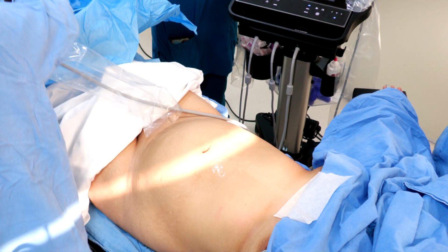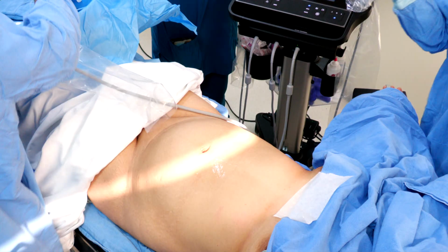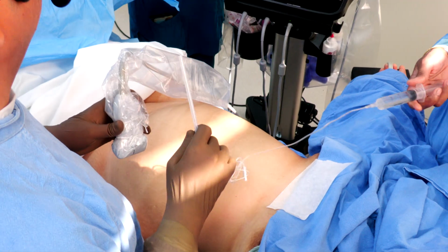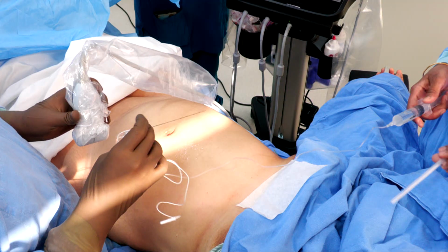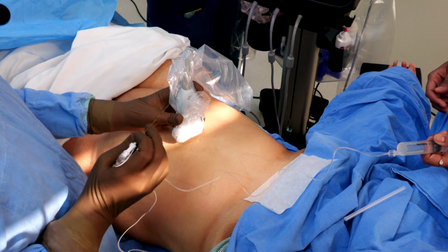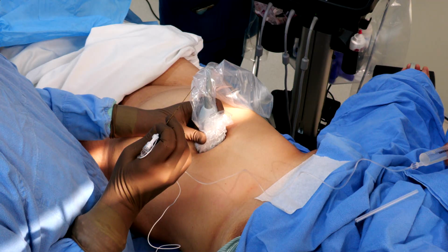So I'm going to demonstrate bilateral rectus sheath block and external oblique intercostal plane block for lap cholecystectomy. I will demonstrate rectus sheath block, one in the short axis and one in the long axis. First, I will start with the scout scanning. I have put the probe above the umbilicus in the midline. You can see the linea alba.